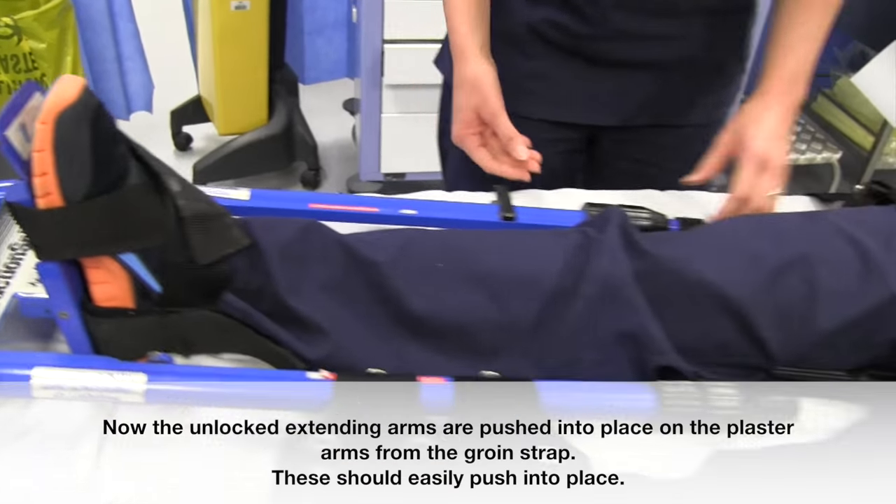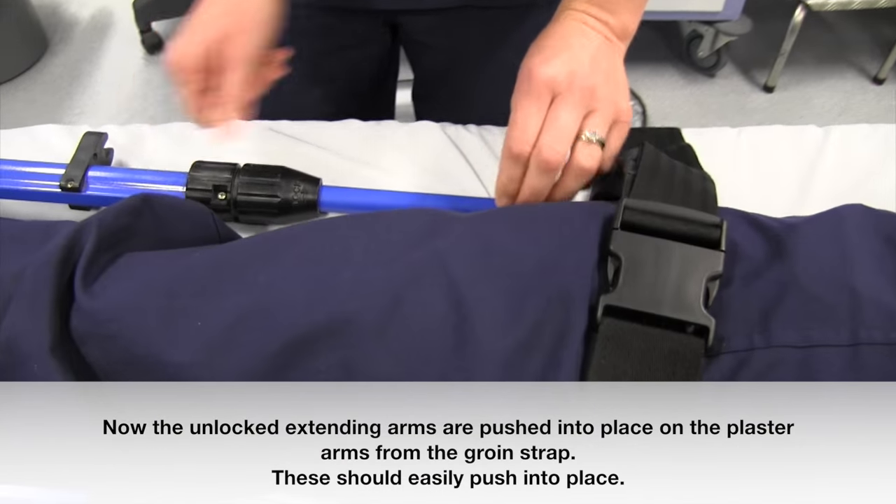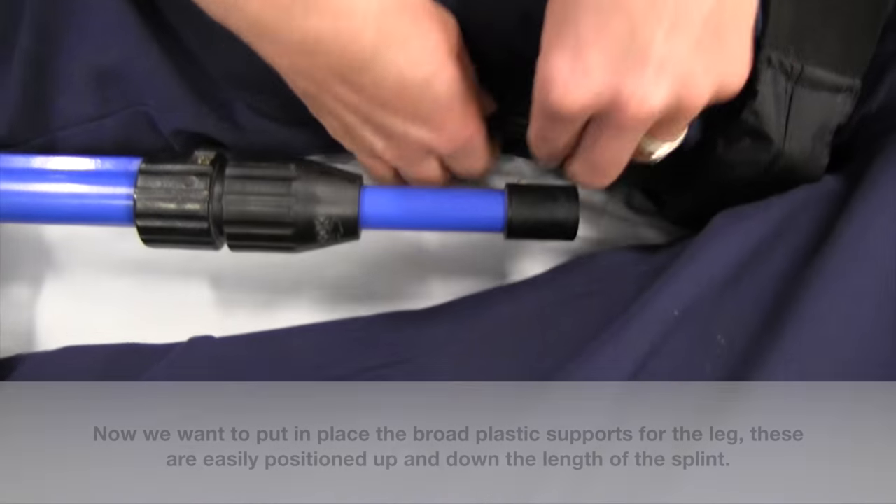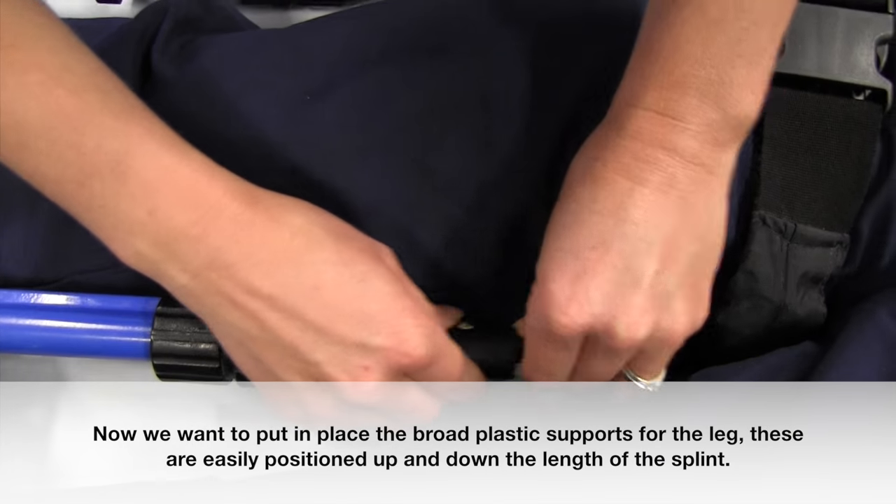Now, the unlocked extending arms are pushed into place on the plastic arms which poke out from the groin strap. These should easily push into place.